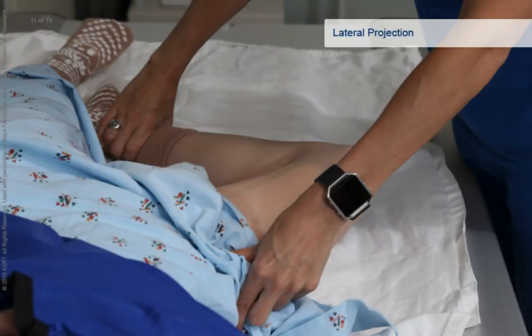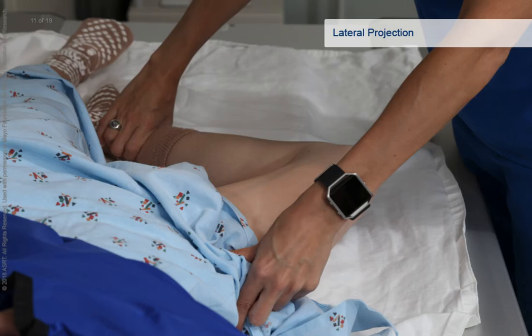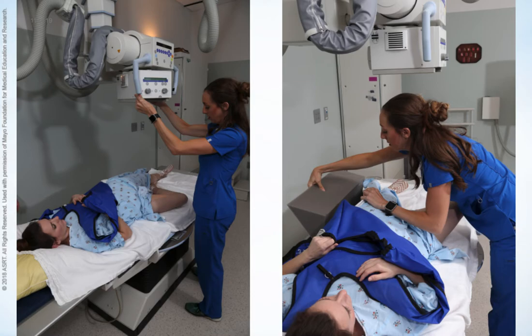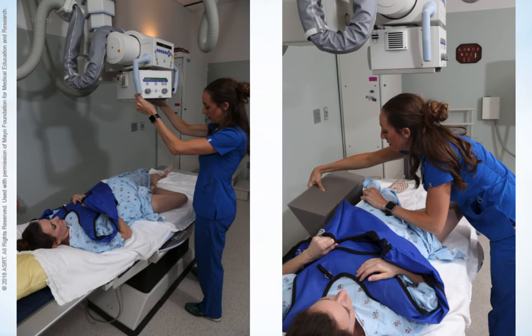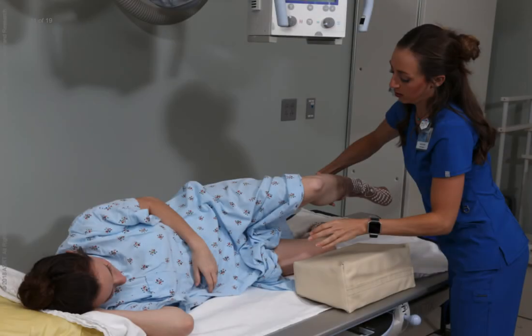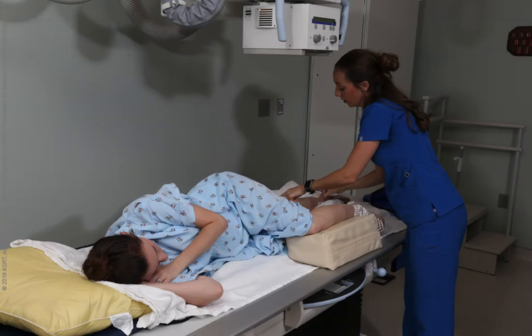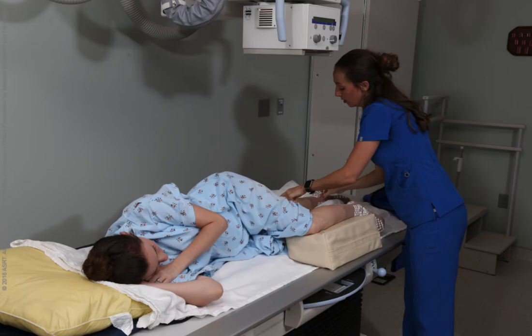The lateral projection is performed with the patient lying on the affected side and the knee flexed approximately 45 degrees. The femur is centered to the midline of the image receptor. To examine the proximal femur, draw the unaffected leg posteriorly and rest it on a positioning sponge or sandbag for support. To prevent superimposition, rotate the pelvis posteriorly approximately 10 to 15 degrees from the lateral position. The top of the image receptor is positioned at the level of the ASIS. To examine the distal femur, draw the unaffected leg forward and rest it on a positioning sponge or sandbag at the level of the hip. Make sure there is minimal superimposition of the opposite thigh over the femur of interest. The patient can also draw the unaffected leg posteriorly, if preferred.